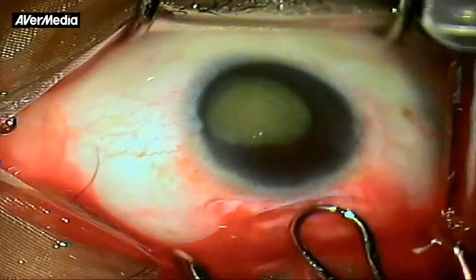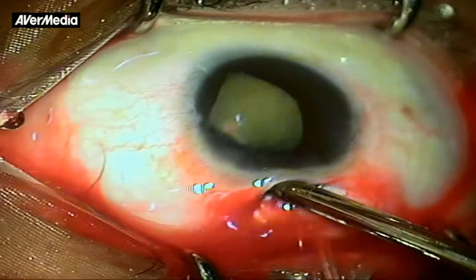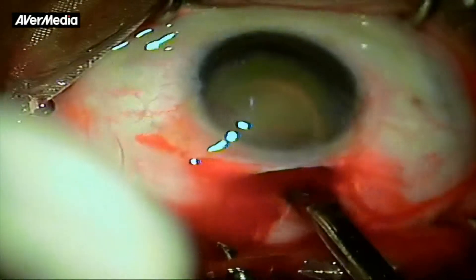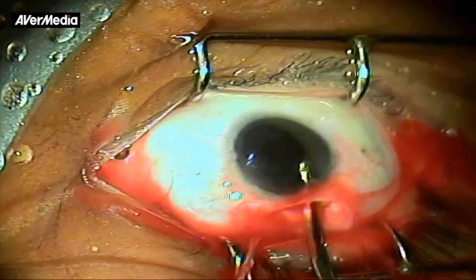Hence, innovatively, the irrigating vectus was introduced inside the capsular bag behind the nucleus. The nucleus was first prolapsed and then delivered in one swift move, taking care not to catch the anterior capsule or iris tissue during the delivery.